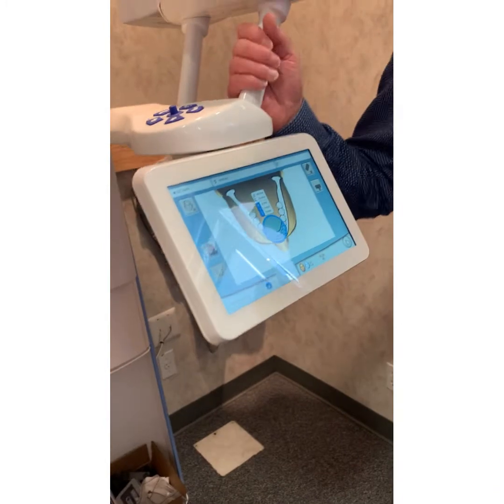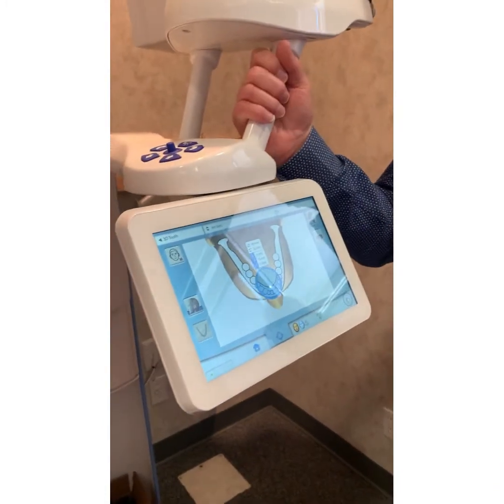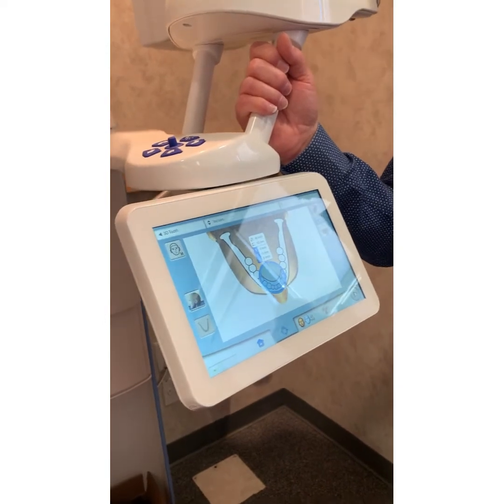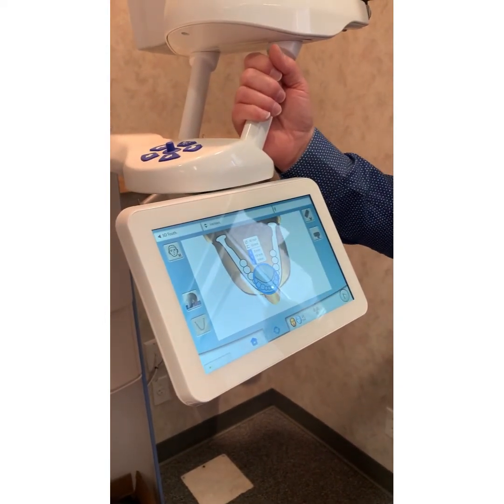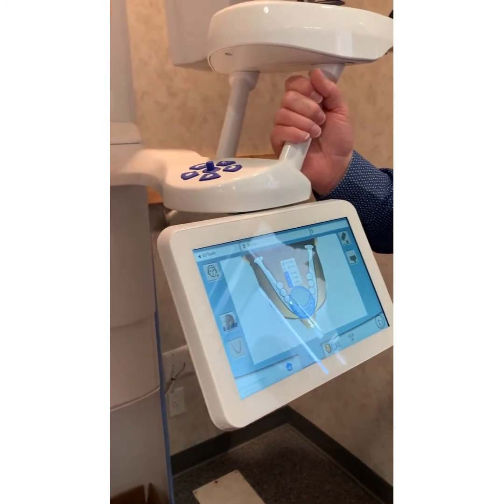How recent is that? I think we didn't have the scout thing back in 2016. Taking a scout, like a test, before you expose somebody? Really? You did. The office wasn't using it. Oh, okay. I wasn't there for the training on that one. The scout serves two purposes, and we've had it since the beginning in different forms.